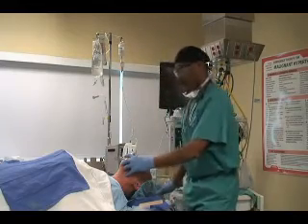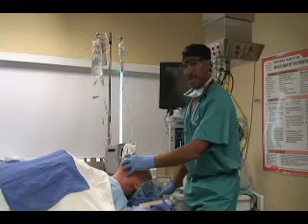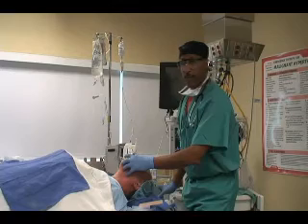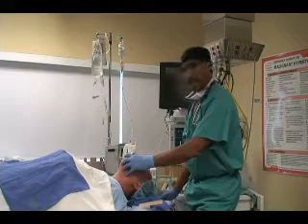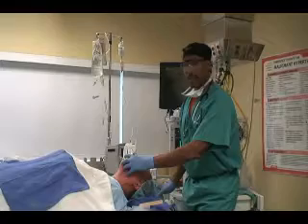From here, I should be able to see condensation on my mask, and as the patient breathes in and out, I can see my bag going up and down. So for ventilation, I'm looking for a rise and fall of the chest, humidification on my bag, and the feel of the bag as I ventilate. Looking back on my machine, I can see end-tidal CO2.